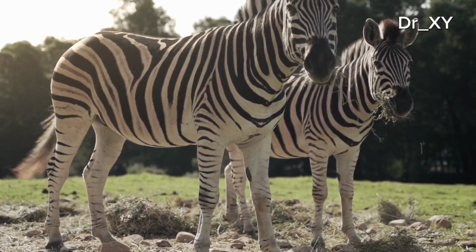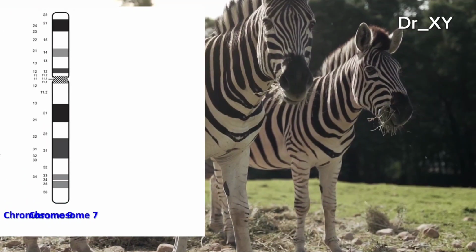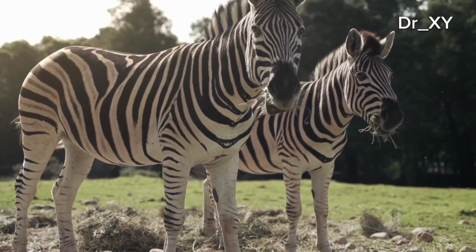So every chromosome will have its own banding pattern, almost like it's the zebra of its own shape. You have light band, dark band, gray band. And so the sequence of them is not random. Using that, we can then recognize which chromosome it is and whether it is normal. So that's the gist of chromosome analysis.